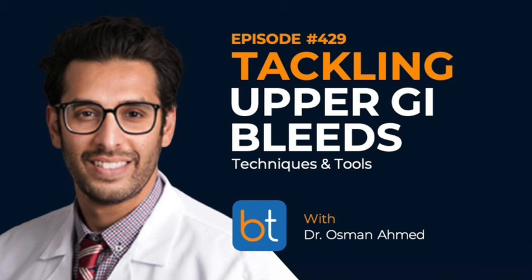100%. I think the value of being able to do injections or runs through your base catheter, your 4 or 5 French catheter, is invaluable. You get way nicer pictures if you're able to do it through there. And you never know what that celiac origin looks like, right? It could be all gunked up with atherosclerotic disease, especially in a little old lady.